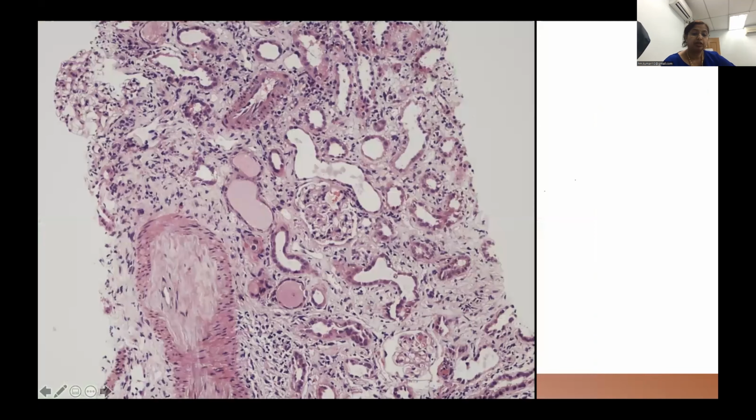This is a long-standing chronic fibrointimal thickening. It's just long-standing and part of atherosclerosis. You have a bit of a lumen there. So these are some of the other lesions you can find.